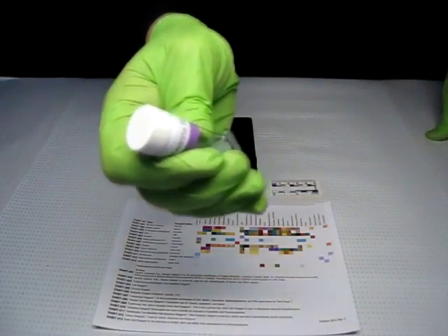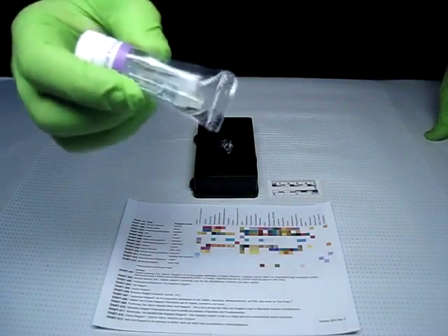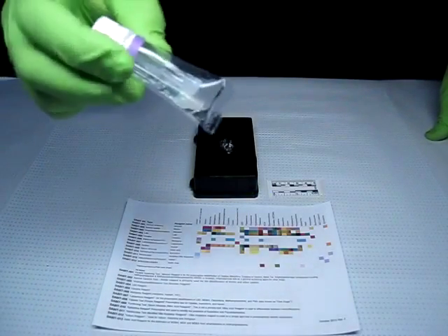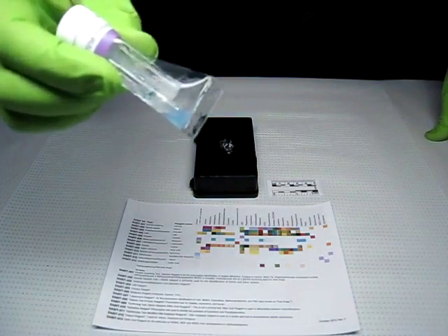The liquid is a light blue. This alone does not indicate a positive result. Look for a color change in the liquid from light blue to purple. Consult with the color chart. Here, the purple color indicates a positive for ephedrine.